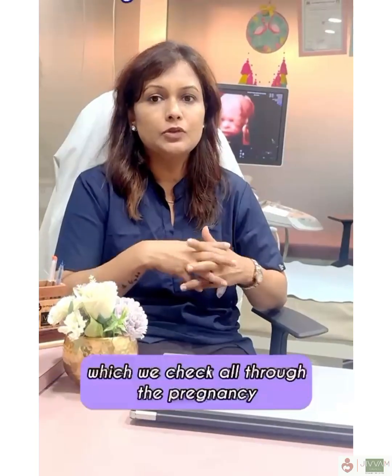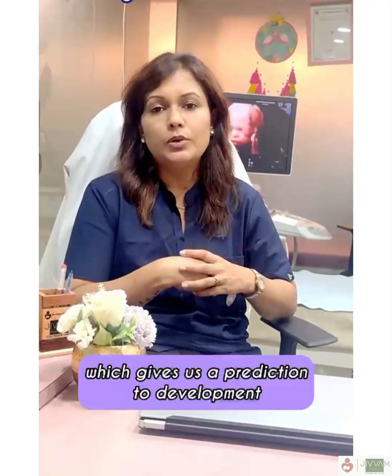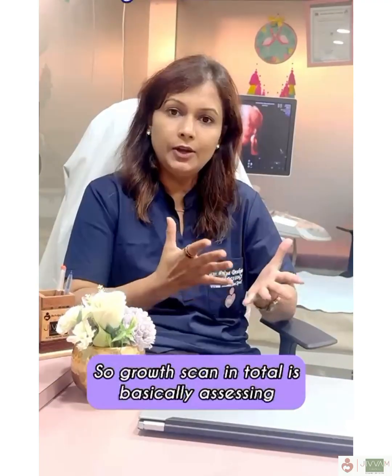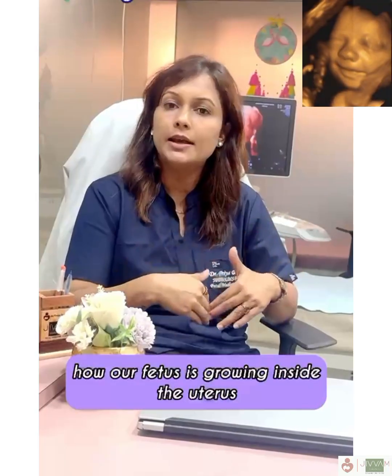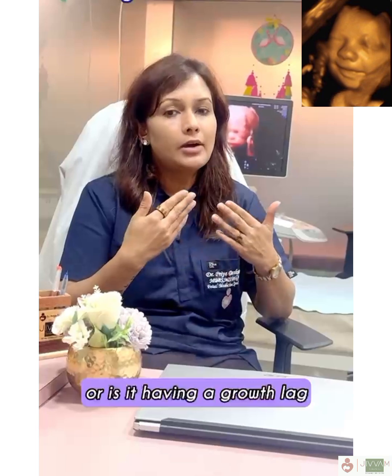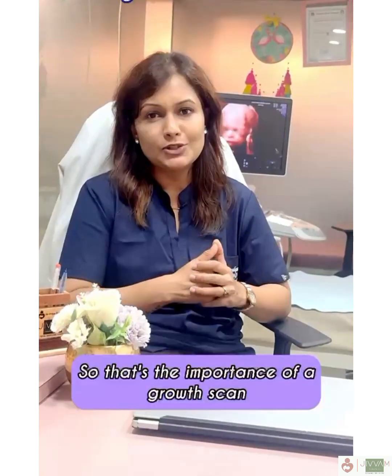Uterine Doppler is something which we check all through the pregnancy, right from the NT scan to the anomaly scan, which gives us a prediction of the development of preeclampsia in the pregnancy. So a growth scan in total is basically assessing how our fetus is growing inside the uterus. Is it growing fine, or is it having a growth lag, or is it growing faster? So that's the importance of a growth scan.